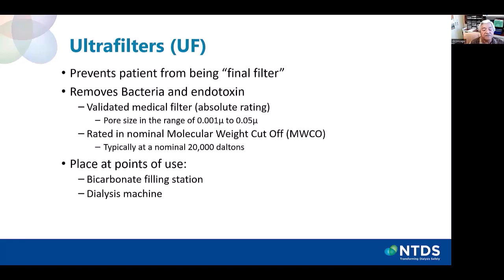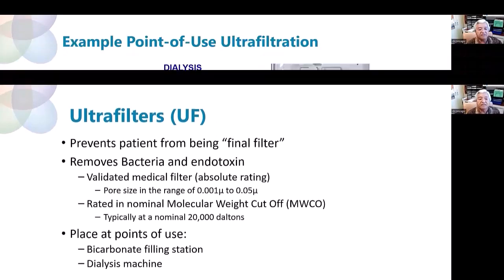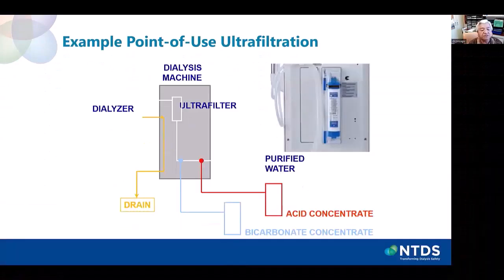Other point-of-use locations for the ultrafilter are in the RO water supply to the manual bicarbonate mixing, and to the Granuflo acid mixing system. As you see in this picture, the typical location of the ultrafilter is on the back of the machine, or in some newer technology, it's actually included internally.